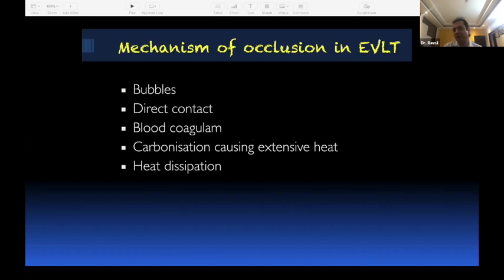According to me and according to all the literature I've gone through, the heat does not go directly into the water of the vein wall, unless you make the vein totally bloodless, then that may be the issue. So that's why, on the question of whether a 1470 laser or a 1940 laser will make a difference, I really don't think so.